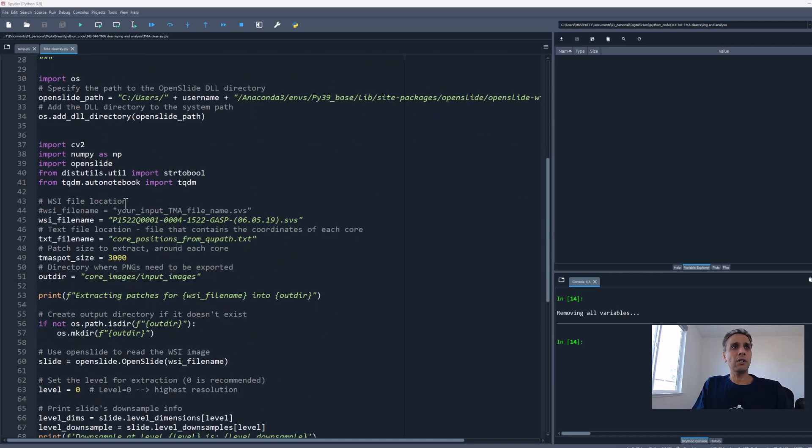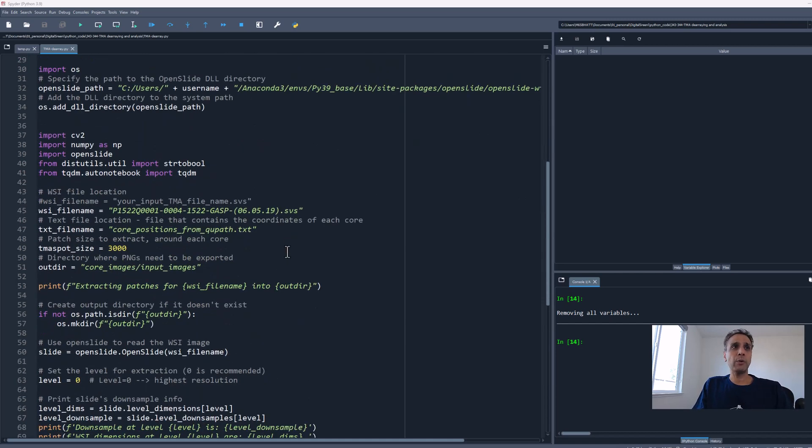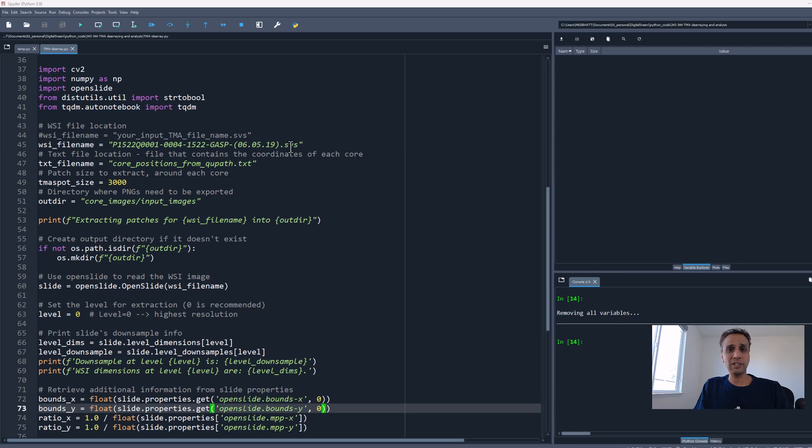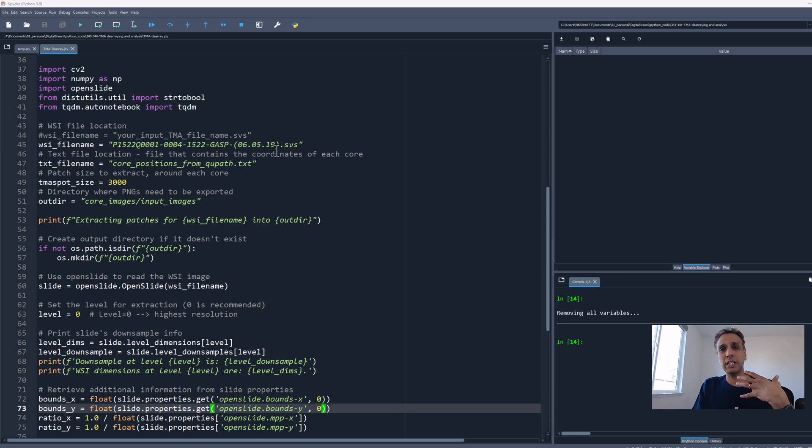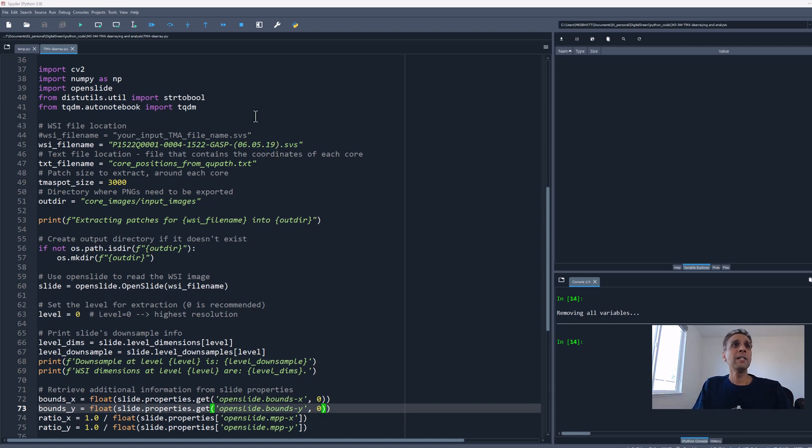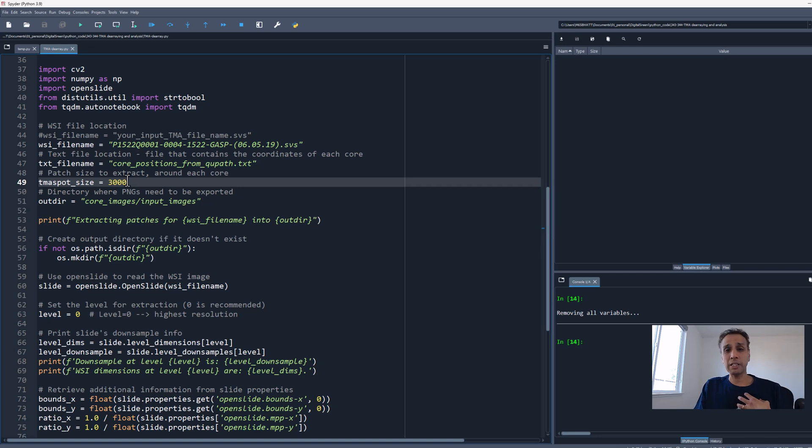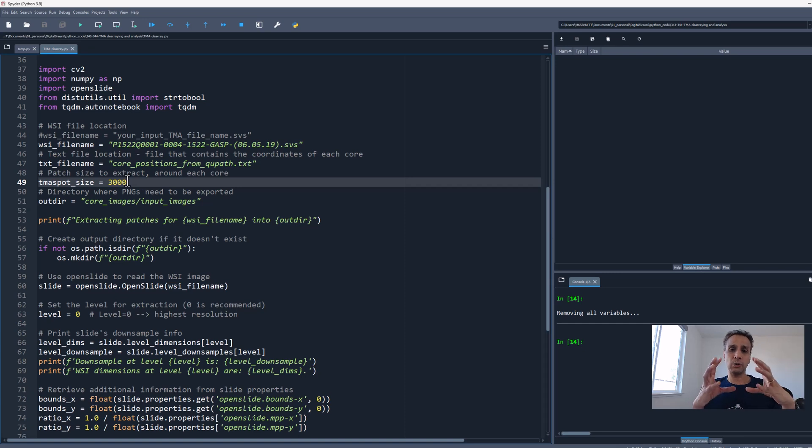After that it's standard stuff. We provide the location of our SVS file—it can be SVS, CZI, just a whole slide image. Of course, the core positions, the text file we downloaded from QuPath, and the spot size. I selected 3000 pixels here.